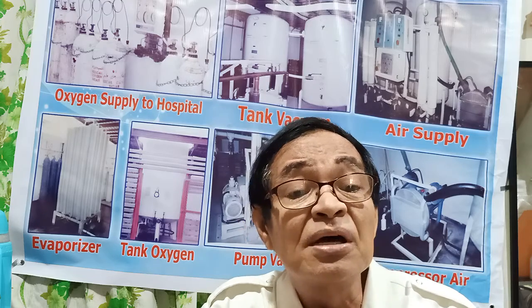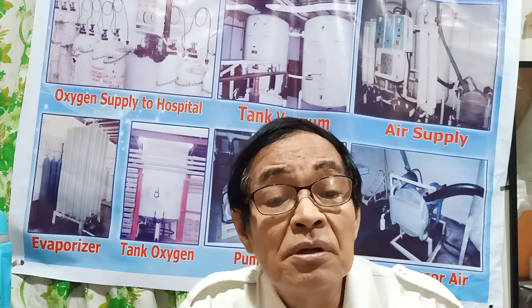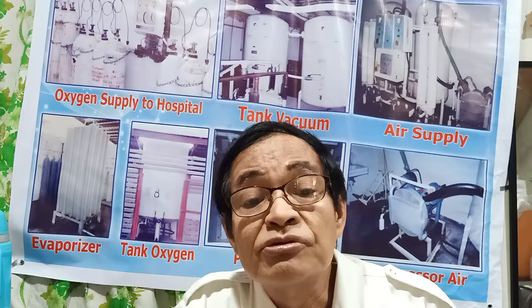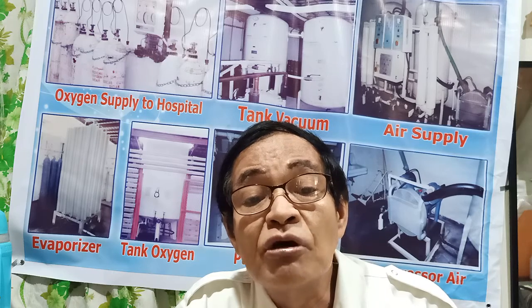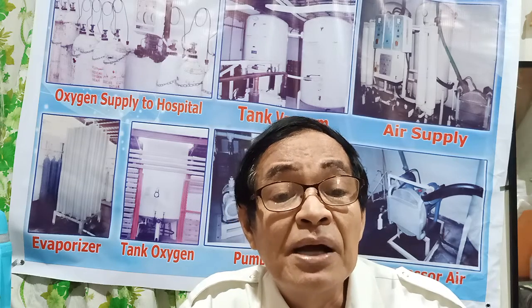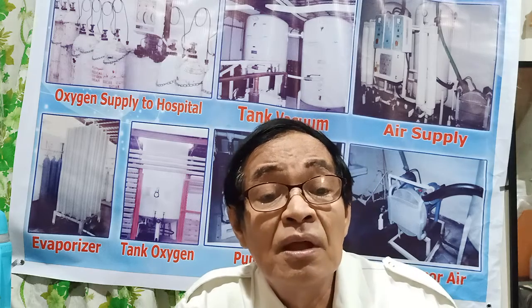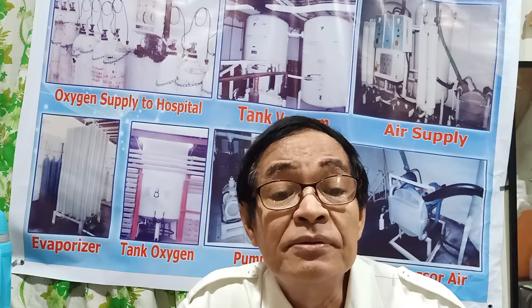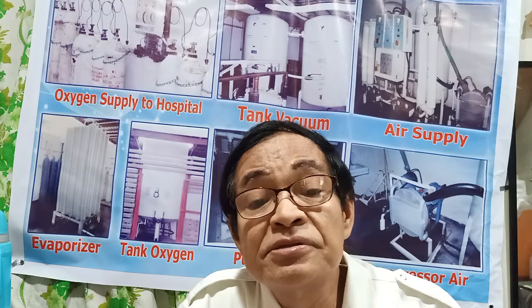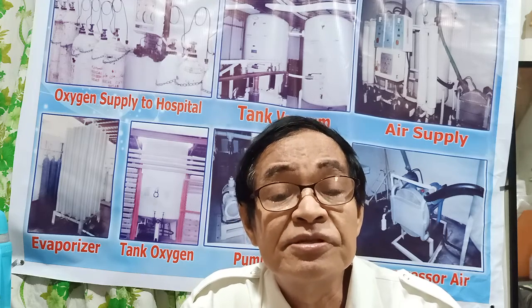The pipe system has a combination of six: oxygen, compressed air, nitrous oxide and nitrogen are positive pressure medical gases. Vacuum and anesthesia gas scavenging systems are negative pressure medical systems.